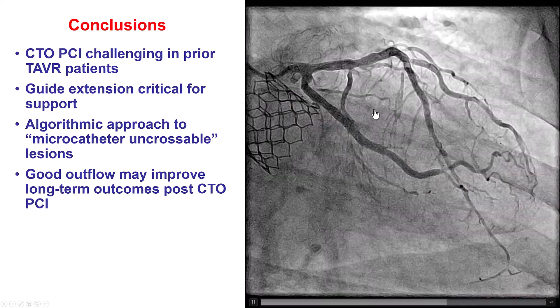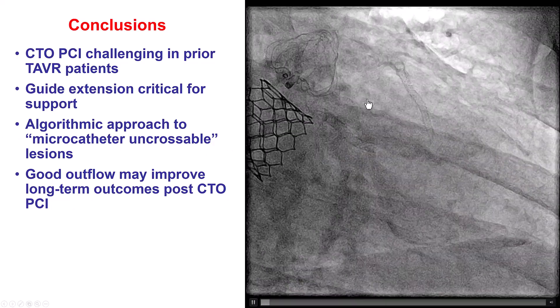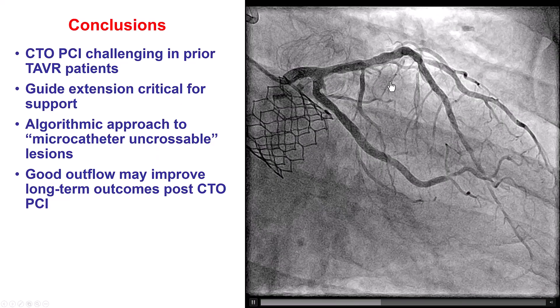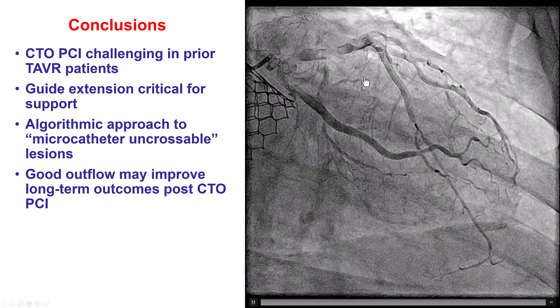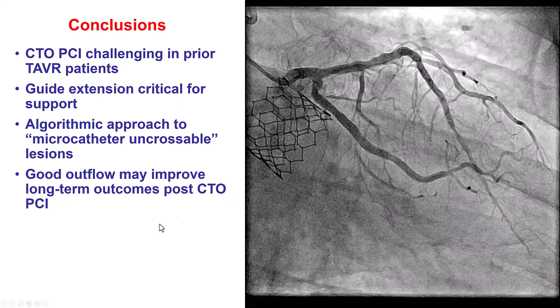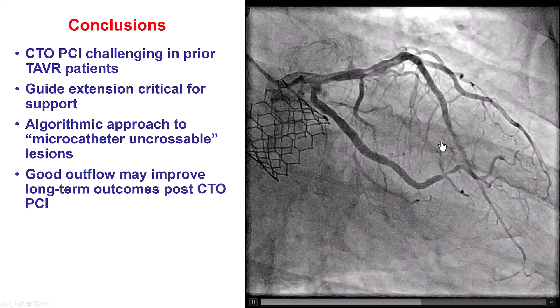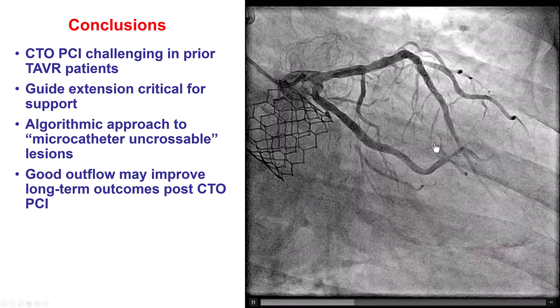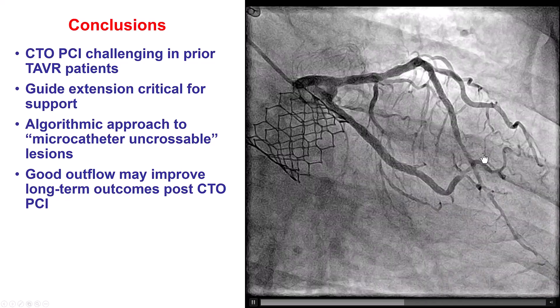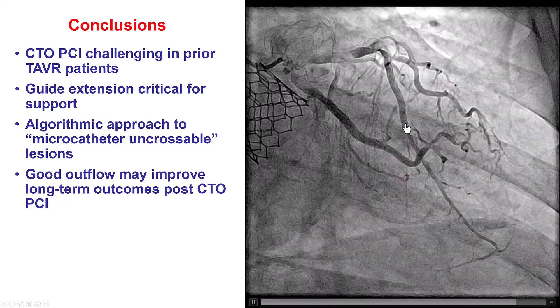Having an algorithmic approach is important. When a lesion is crossed by a wire but nothing else will cross, the first step is to get a small balloon. In our case that was not enough because support was insufficient. The next step is sometimes to rupture the balloon, sometimes to get more support — achieved here by deep-seating the guide extension. There was diffuse disease distally impairing antegrade flow, resolved by prolonged balloon inflation with a 2.0 mm balloon. Having good outflow distally is important for maximizing stent patency and minimizing the risk of stent thrombosis.